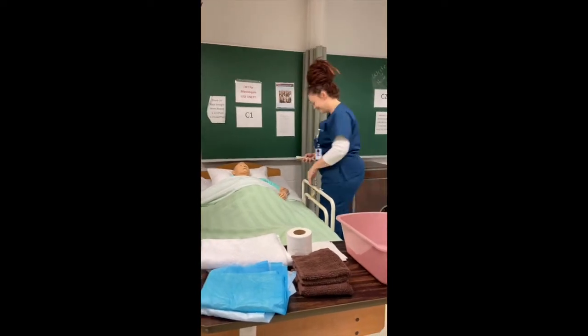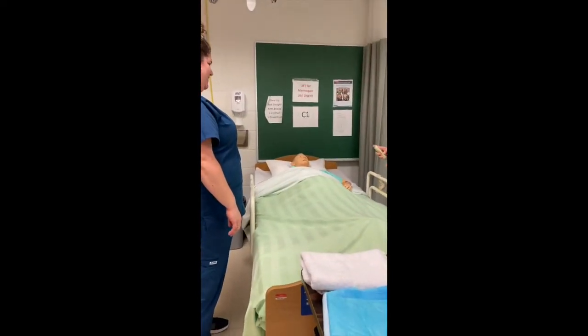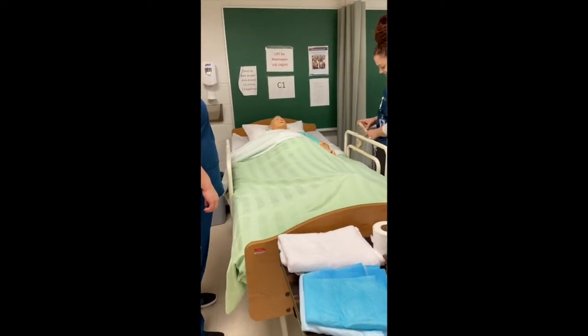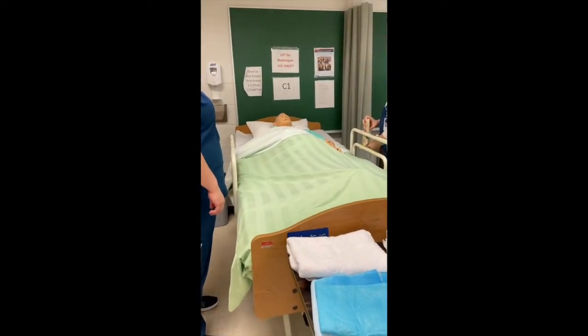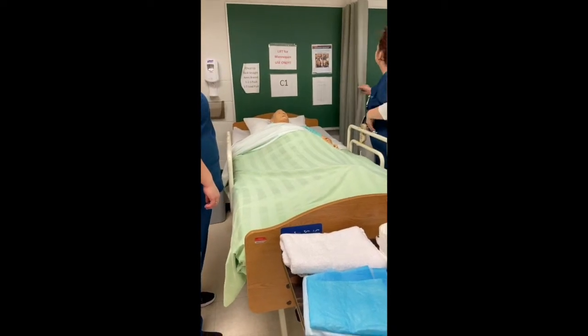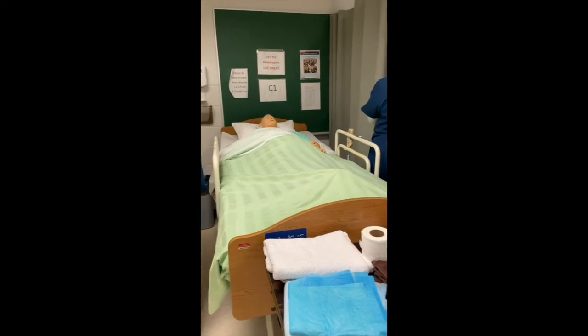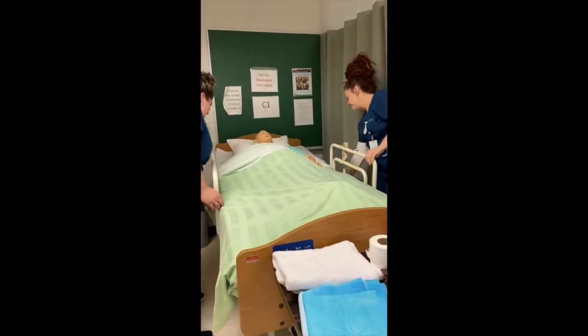We raise the bed to working height. We also provide privacy. We lower the bed rails and we don clean gloves.